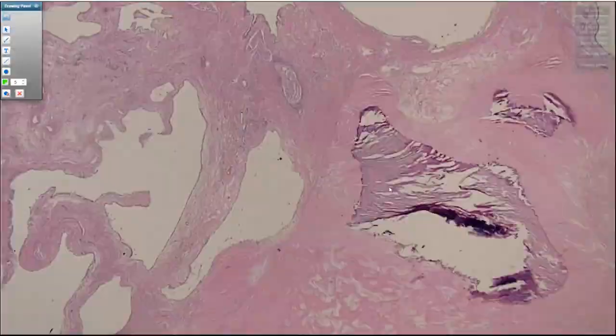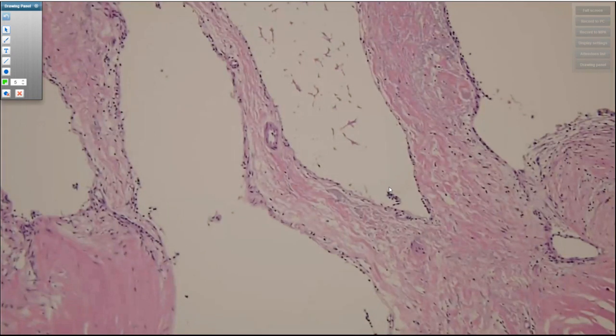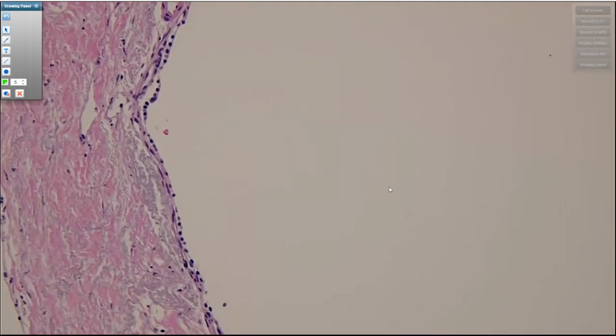And so certainly a good portion of it looked very much like we would anticipate for a serous cystadenoma. There were lots of degenerative changes, lots of scarring, which correlates with that central scar they saw in imaging. And then the lining, very simple, very bland, small round cells with cleared cytoplasm. So all seems fine for a serous cystadenoma.